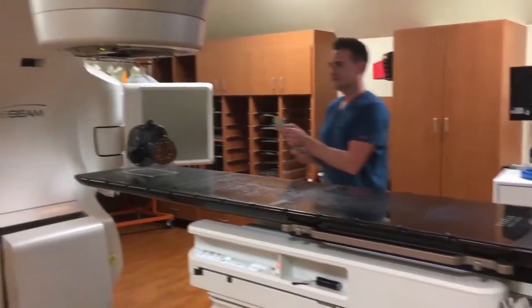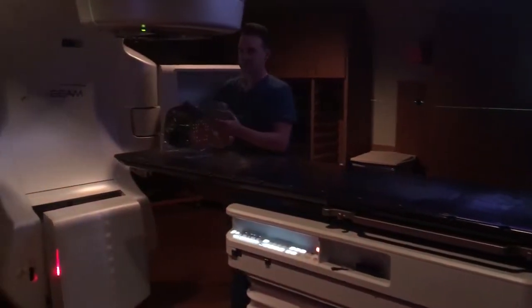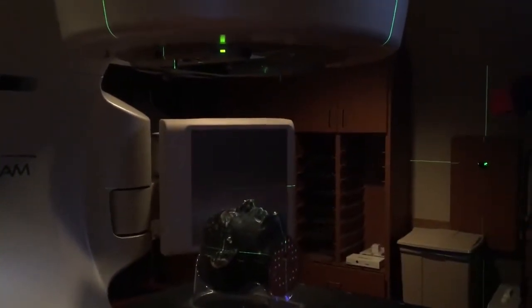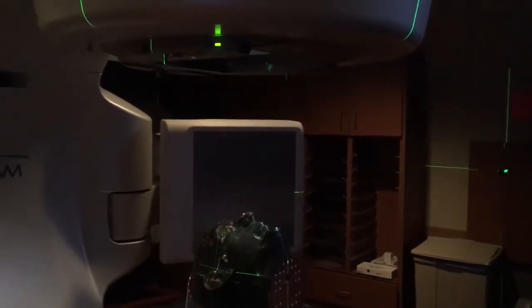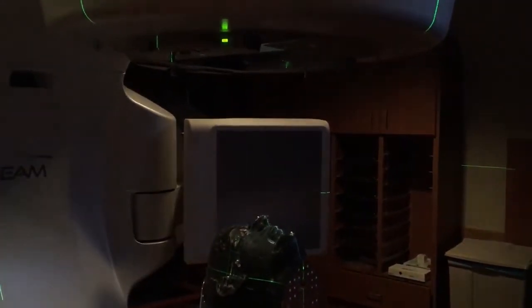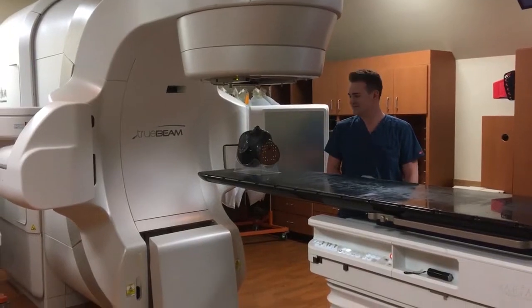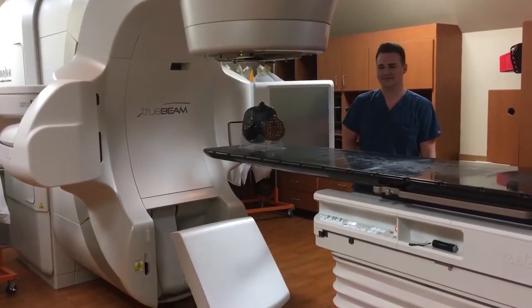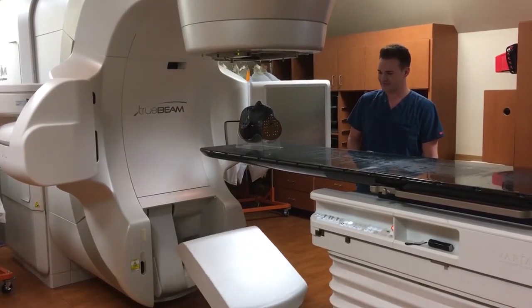Once the patient is positioned well, the lights are turned off so that you can see the lasers. The lasers are then lined up with the tattoos or marks that are placed on the patient at the time of simulation to represent the isocenter. Now we will pull out the MV imaging panel to take our first portal film.